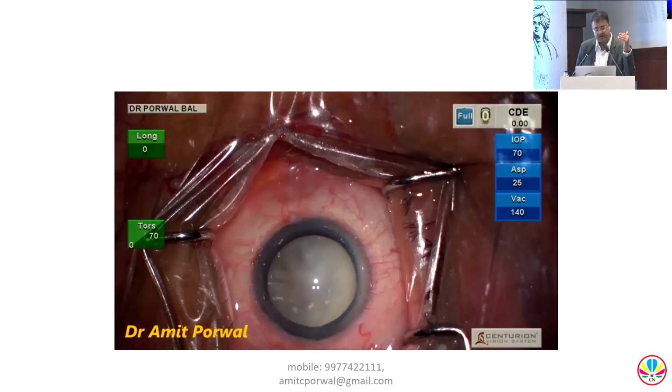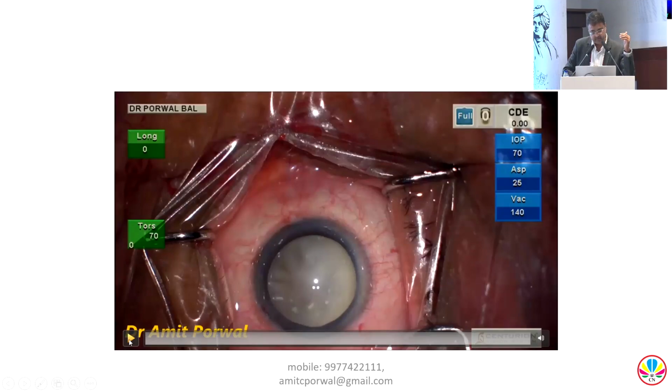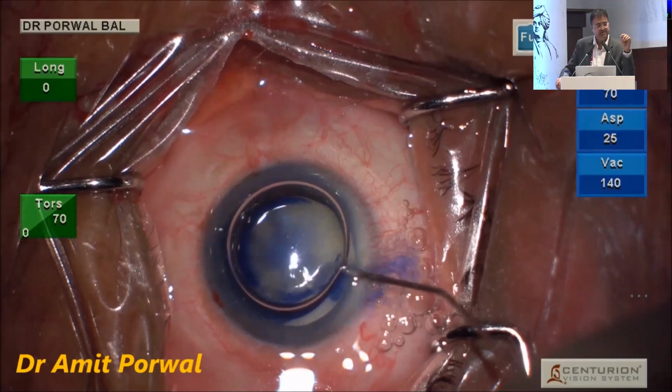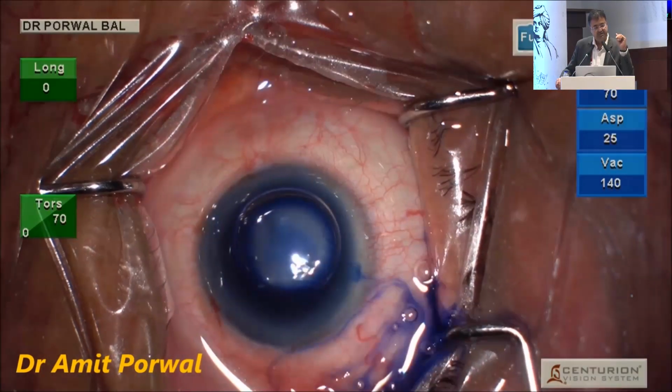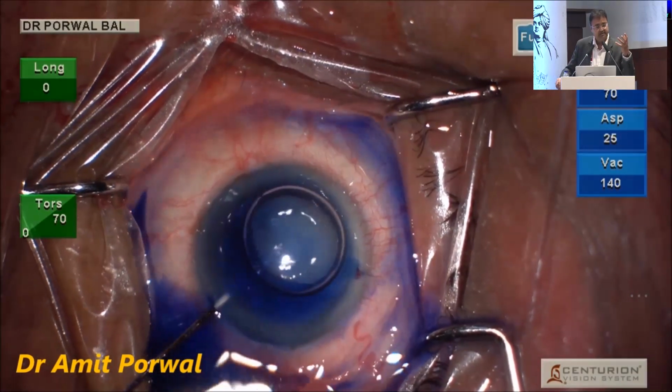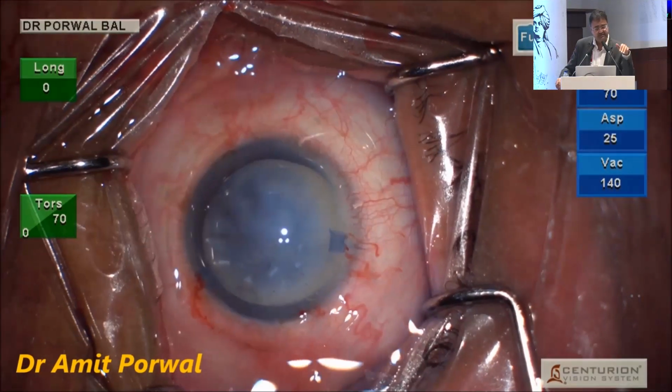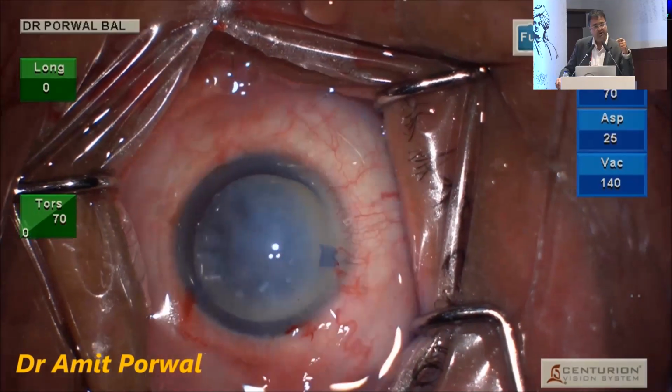Coming to hypermature cataracts. How are you going to deal with these hypermature cataracts? Most of the time you will encounter some calcified spots on the anterior capsule here and there. They will be Morgagnian type. So when you are doing the rhexis also, the nucleus will move here and there. You don't have enough rigidity.